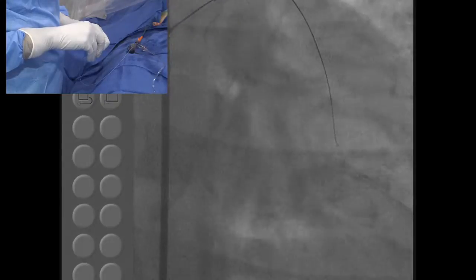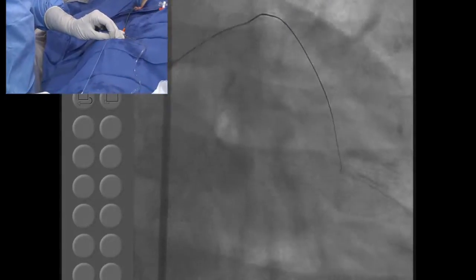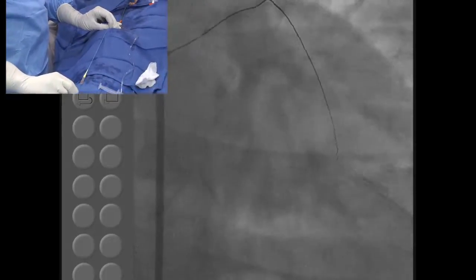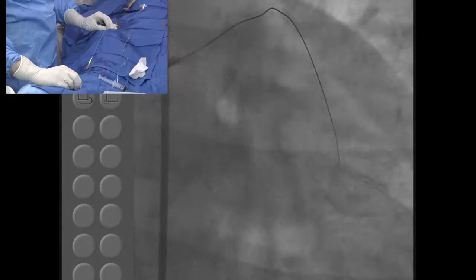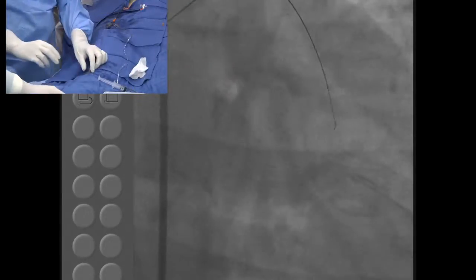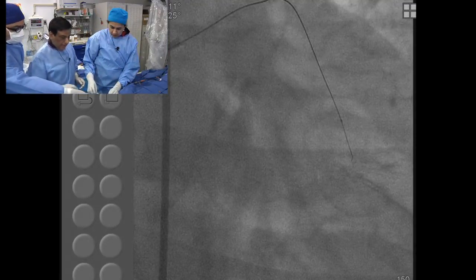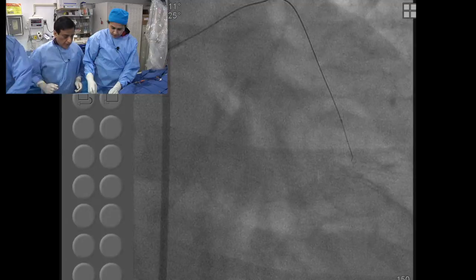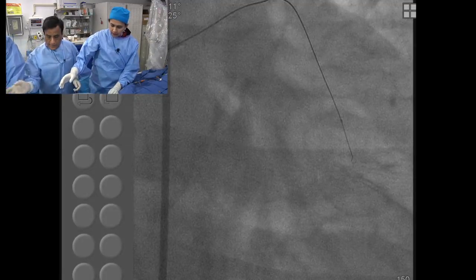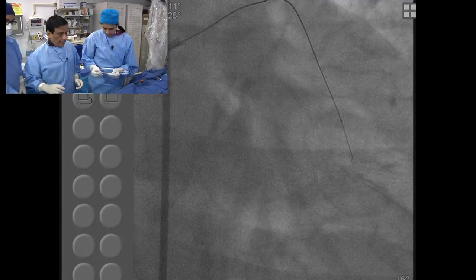How many bare metal stents did you use in 2014? We have actually about 5.6% at Mount Sinai. So maybe 94% plus have been a DES. And you wouldn't know clearly the newer versus the older, I'm sure almost 90% are the newest generation? No, all newest. Actually, in our lab, basically, we have two: Workhorse Promus and Xience. We have used some cases with a Resolute Integrity, but the bare metal is all Integrity at Mount Sinai.